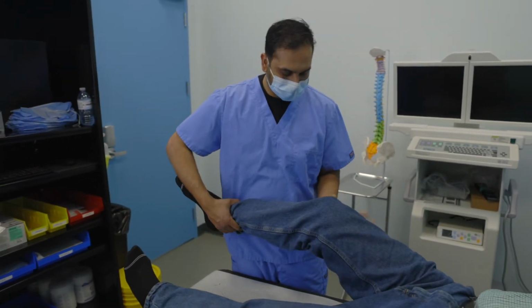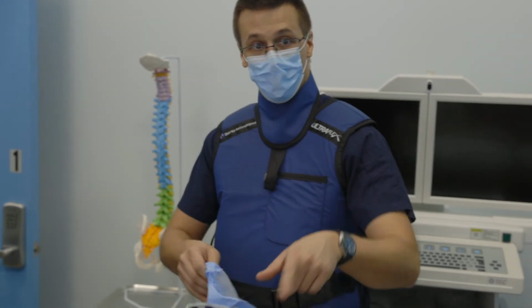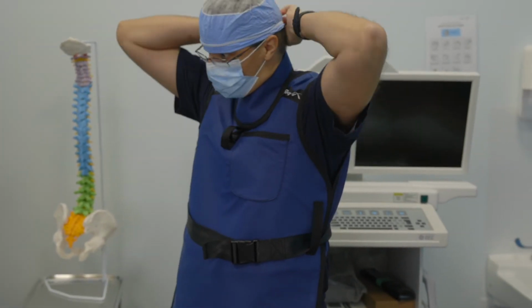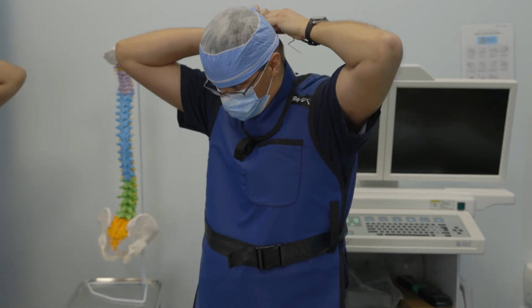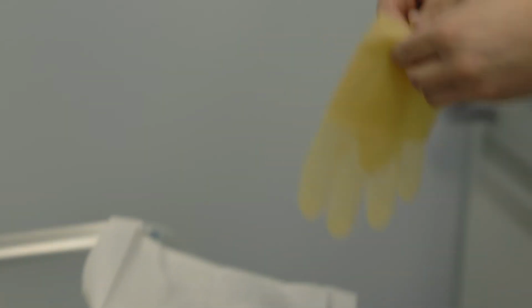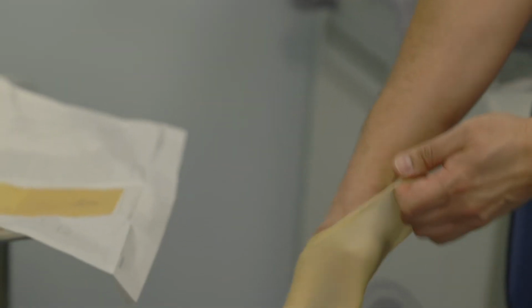Dr. K will answer any questions you may have, and you will meet the X-ray or ultrasound technician that will assist with your case. Dr. V is the chief of our spine pain program at Bloor Pain Specialists. He or one of the other interventional pain management specialists will join you to complete your consent form, answer additional questions, get you positioned for the procedure, and will clean and disinfect the skin over top the body part that is being treated. If you are having a knee procedure, for example, the skin around your knee will be disinfected. If the procedure is an injection in your back, it will be cleaned with a sterile disinfectant.